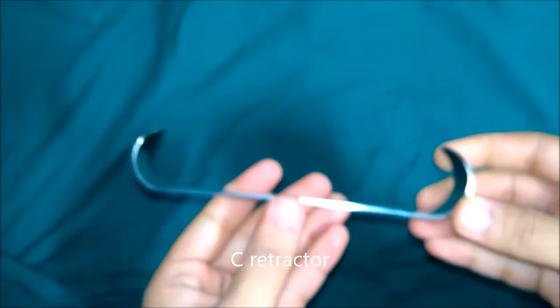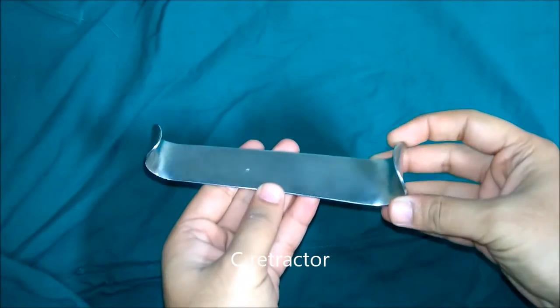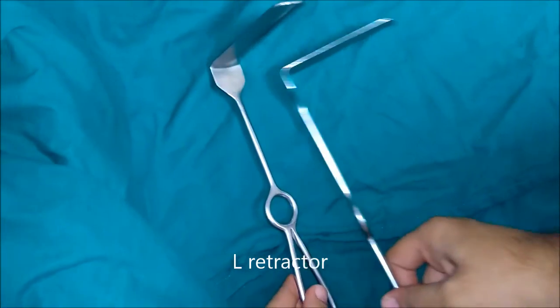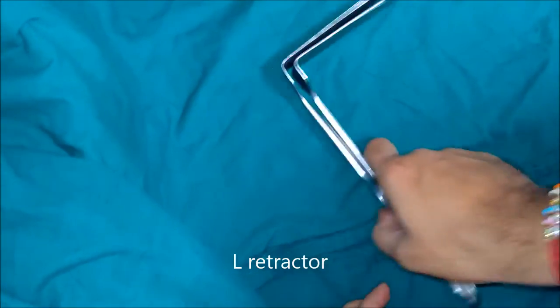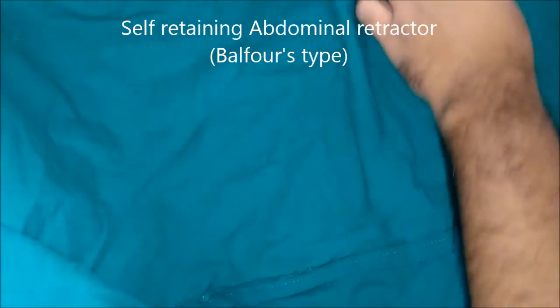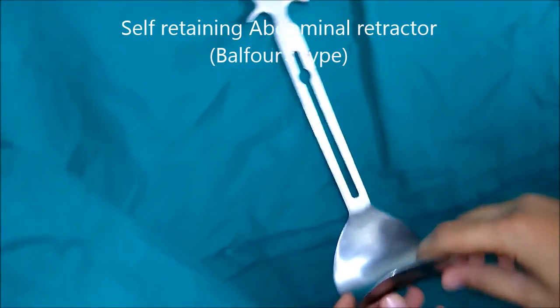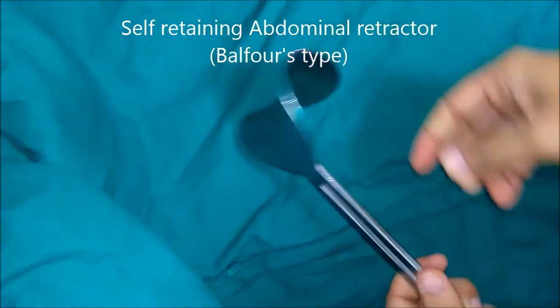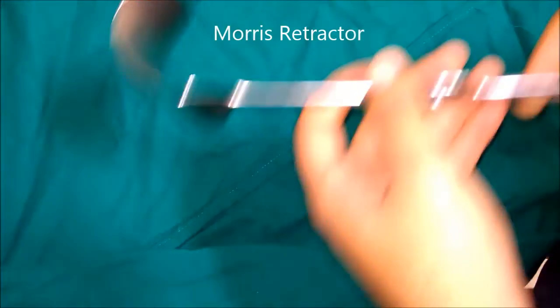This is a C retractor. These are L retractors. This is a self-retaining abdominal retractor of the Balfour type, which also has a provision for attachment of a third blade. This is Morris retractor.